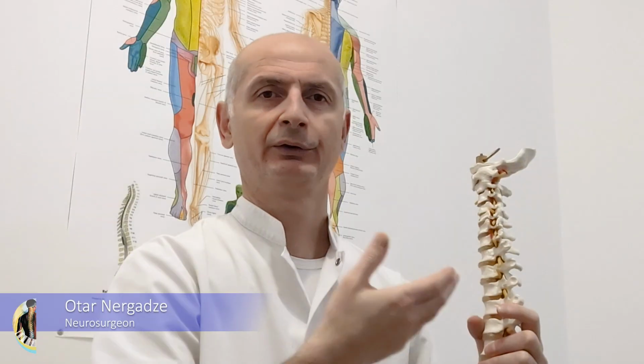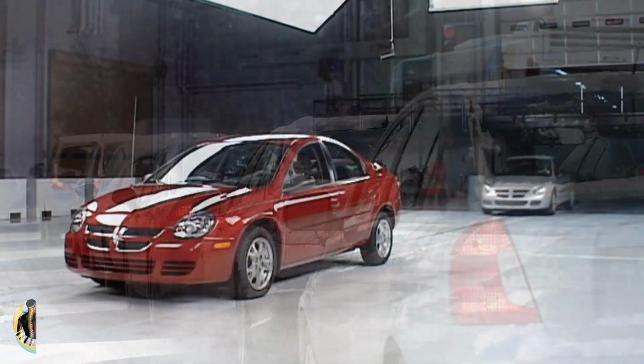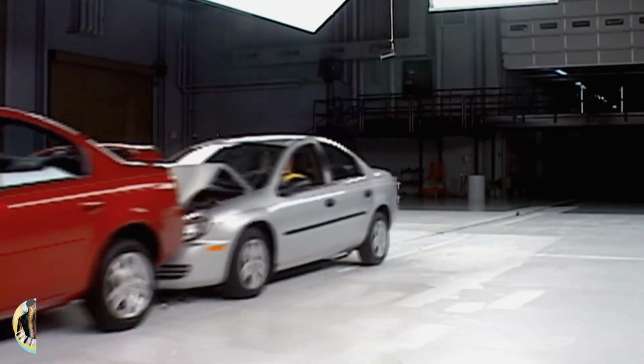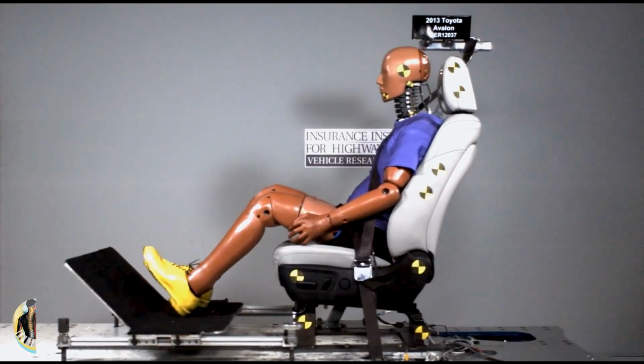Hello! In today's video, I will show you how cervical spine MRI detects whiplash-associated disorder and ligament sprain. Picture this. You're stopped at a red light, minding your own business, when suddenly, bam, you get rear-ended. Your head snaps forward and back. You have severe neck pain, stiffness, and a pounding headache.